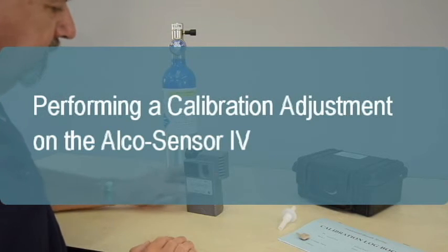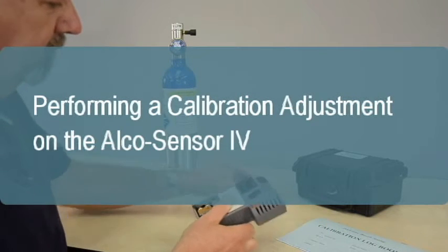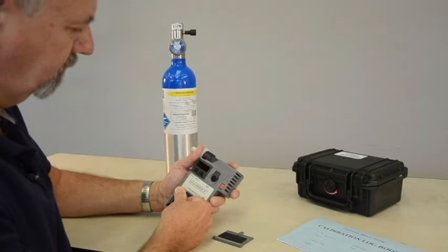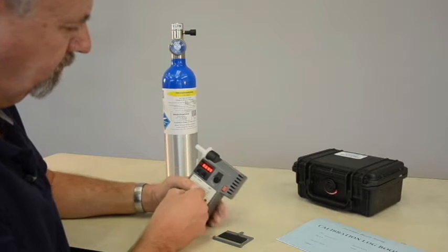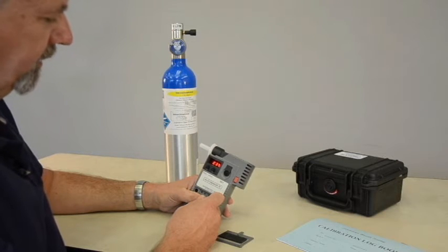AlkaSensor 4 instruments typically hold their calibration for months or even years without needing adjustment. Intoximeters does not require that the instruments be periodically calibrated. A calibration adjustment need only be performed if an accuracy check on the instrument has failed.